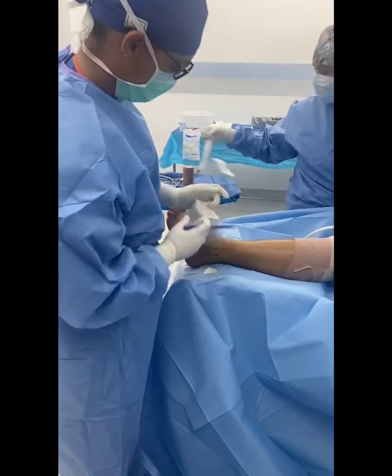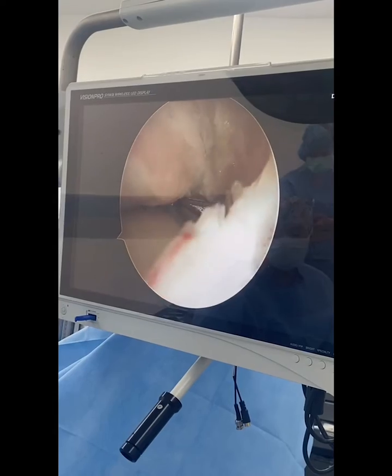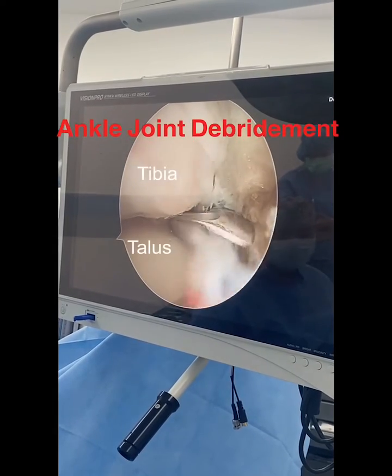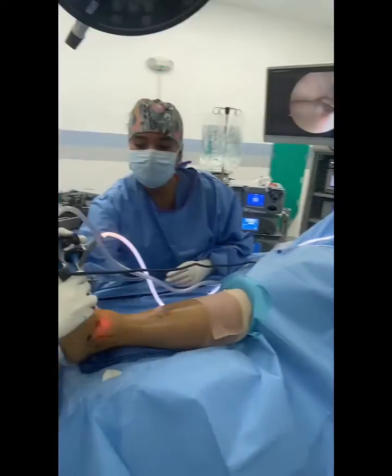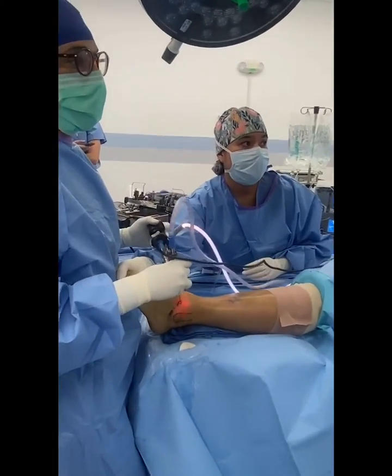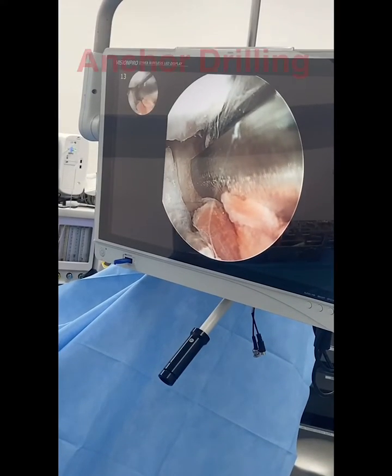I first start with an ankle joint arthroscopy, allowing me to visualize the joint. You can see here the patient also has a lesion to their talus — an osteochondral lesion — and I'll talk about that on another video. But I go in initially with the camera and assess for synovitis and remove any impinging debris.